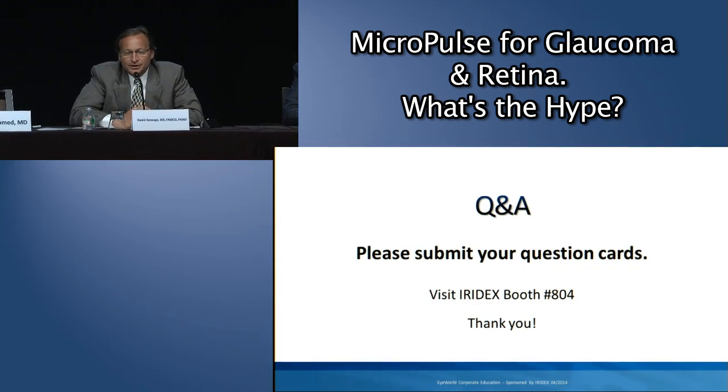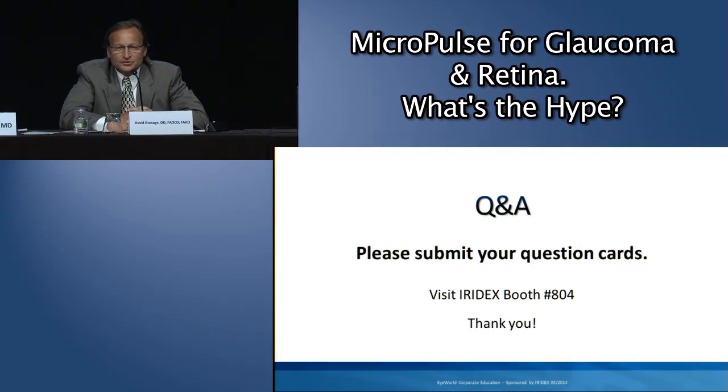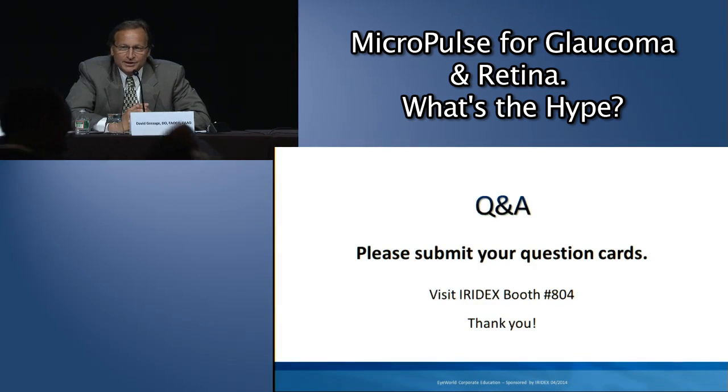Well, with repeatability, early on when I was treating with 300 milliwatts and 700 milliwatts, some of those patients didn't get the pressure lowering effect that I was looking for, so then I would use 1,000 milliwatts in those patients and found that I could get additional effects. So from a repeatability standpoint, I'm kind of limited in how many patients that I've actually repeated with 1,000 milliwatts alone. Probably I have maybe a handful or less of those patients that were treated at 1,000 milliwatts that I've had to repeat treatment. When I did apply treatment again, though, they did respond. So from a standpoint of repeatability, it's a very limited number, but those patients did have an additional effect from that.